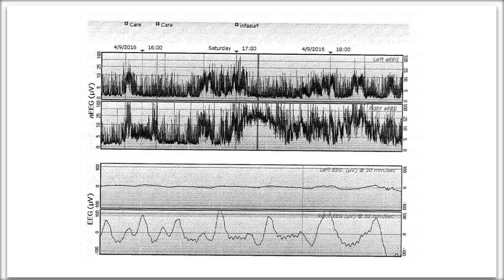So let's see. Gabriel had said it's very common during long monitoring, but they definitely do not look like seizures. Yeah, it's definitely a pathological trace. So Gabriel's just texting in that they don't look like seizures, but it's definitely a pathological trace.